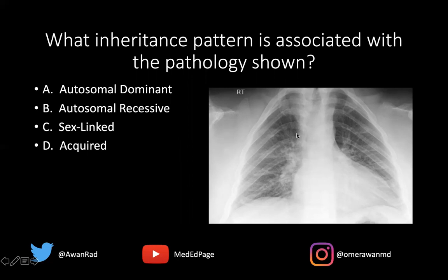Then we want to look at the bones. This is an MSK case, so we want to trace the ribs, make sure we don't have any rib fractures or rib lesions. We do that on the right side and along the left side — starting posterior, posterior lateral coming anterior. But sometimes the hardest thing about these types of cases is recognizing what's not there that's supposed to be there.